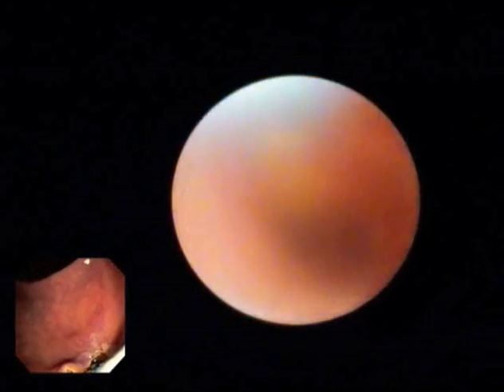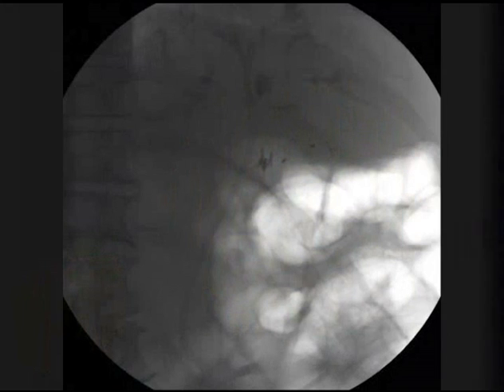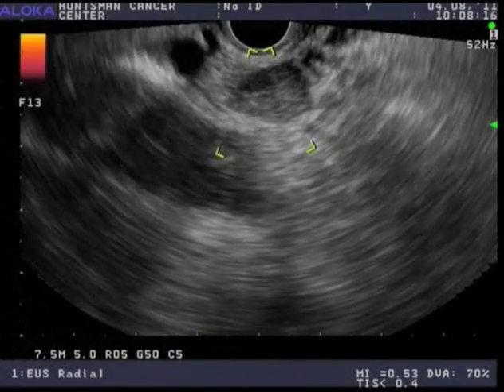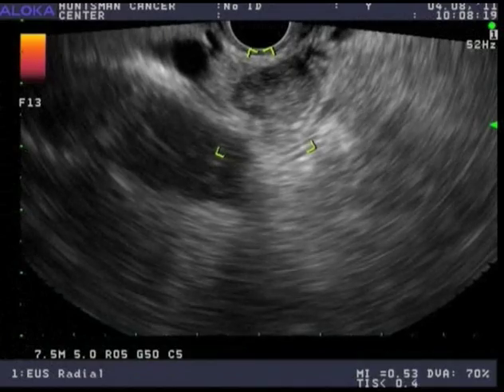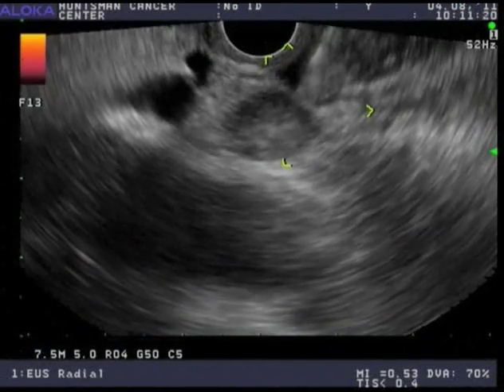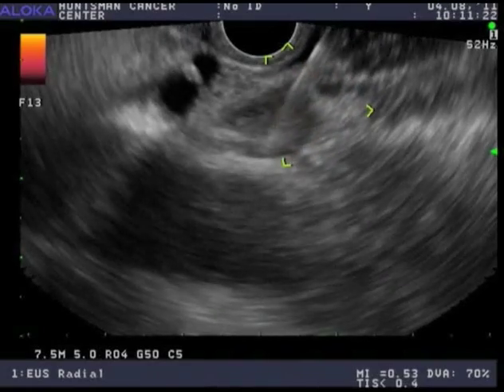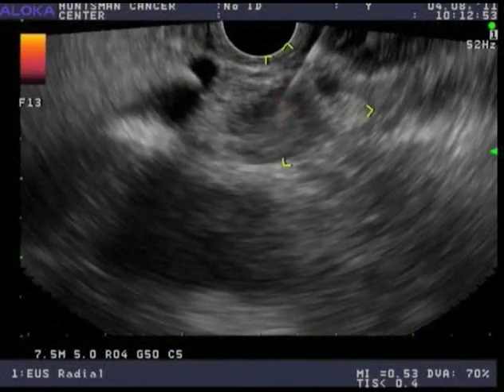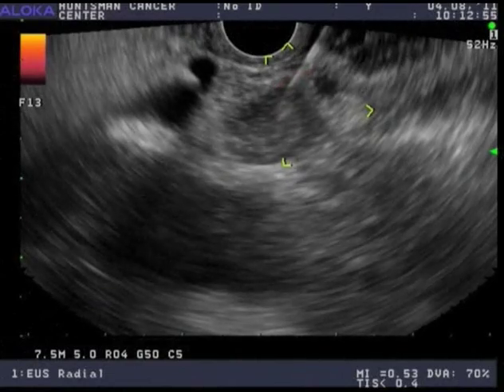Tissue was sent for histologic evaluation. We then placed an eight and a half French by 15 centimeter long plastic biliary stent with excellent drainage of bile and contrast seen. We then performed endoscopic ultrasound and identified a 15 millimeter periportal lymph node, which was sampled by EUS-guided fine needle aspiration. Tissue was obtained and sent for cytopathologic analysis.